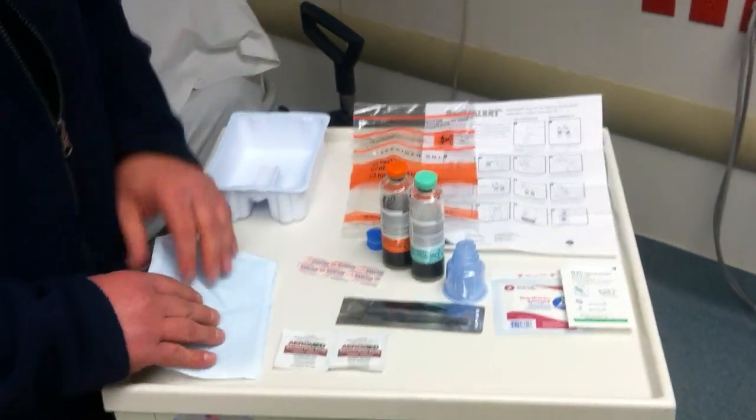First, as always, we want to identify the patient with two unique identifiers. Identify the last name and first name by asking the patient to properly spell both, and also their date of birth. Confirm that with the physician orders and also the ID band on the patient. Once that's confirmed, we continue with our collection.